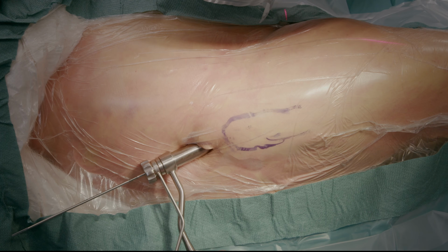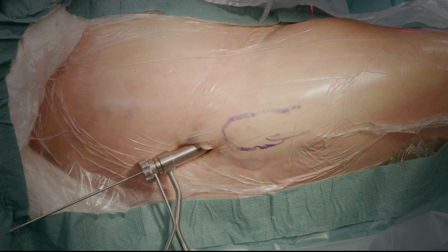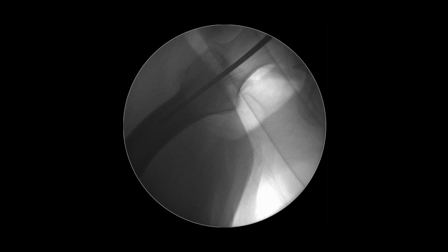The image looks good. Then let's take the true lateral view as well, using the 15-degree tilt as mentioned earlier. The wire appears to be nicely located in the intramedullary canal in the femur, also in this lateral view.